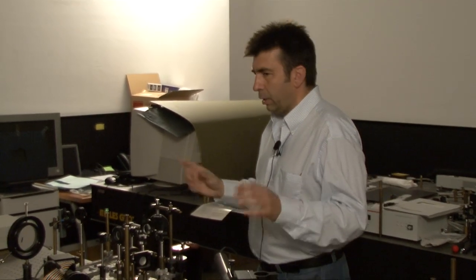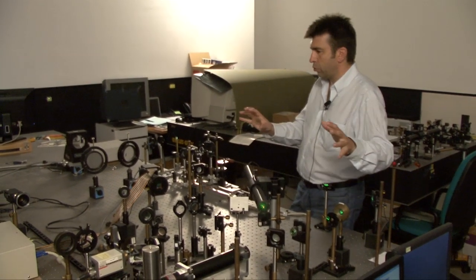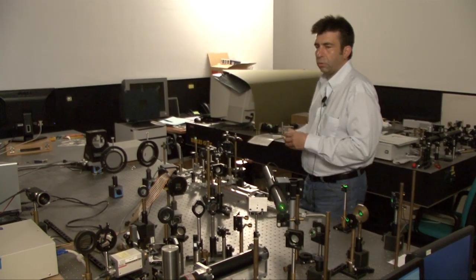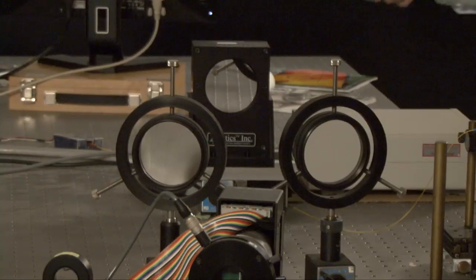This is our instrument. This is our adaptive optics visual simulator. The idea of this instrument that we built, all these optics, lenses, electronics, computer, is to introduce in the subject's eye the optics that we want to really produce. The central elements of the instrument are these two here. This is a deformable mirror.